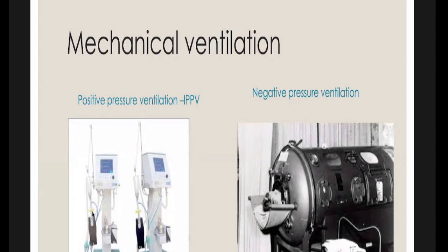At the end you can see a yellowish circle, which is the filter, and here the test lung is hanging, so that the ventilator is tested on the test lung before it goes on to the patient. You also have the humidifier and the air warmer. That is incorporated because this is an artificial system.